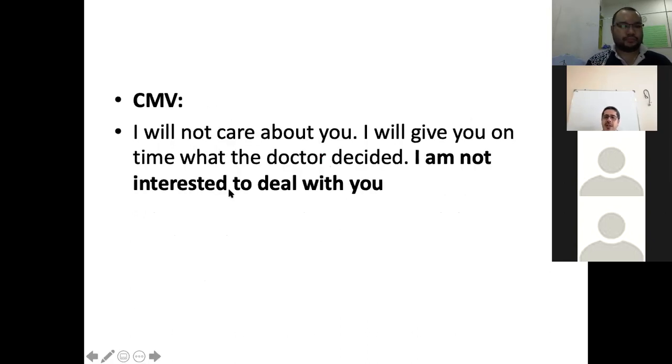Okay. Next, CMV, which is not used now. I will not care about you. I will give you on time what the doctor decides. I am not interested to deal with you. So this mode is a tough mode. Like you make the setting 30 breaths per minute, so it will give 30 controlled breaths. And I will not respond to the trigger by the patient.